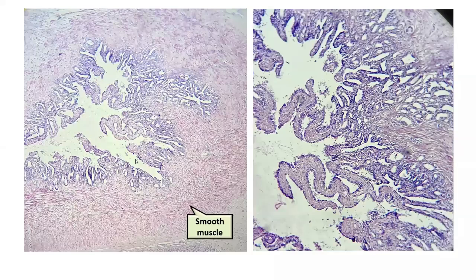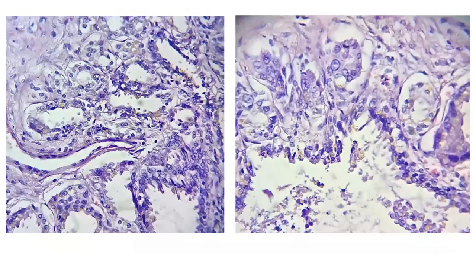This is an actual histological section from one of my routine prostatectomy specimens. As you see, there's a well-developed lumen with complex papillary infoldings, and I appreciate the very well-developed layer of smooth muscle around this structure. Looking at it at higher power, see that because of the sectioning, some of these papillary infoldings appear to look like query atypical tubular glands. But then again, you have to appreciate that there is quite a good amount of pleomorphism between the cells, and you get to see this intracytoplasmic pigment as well.